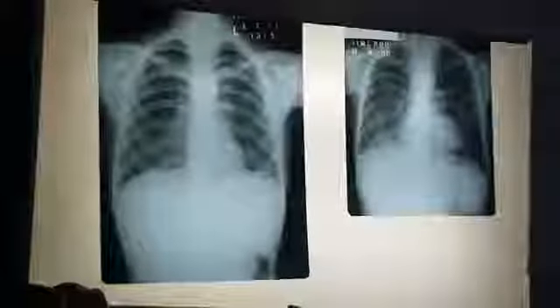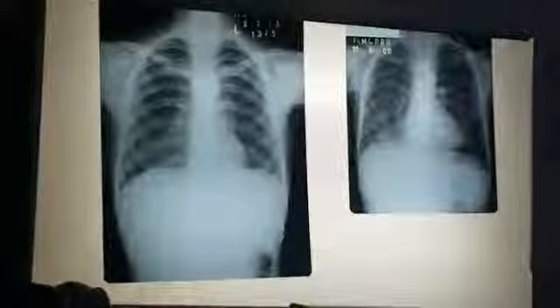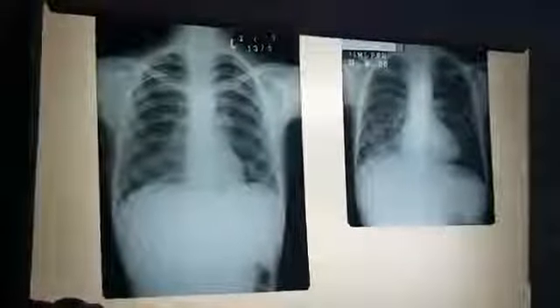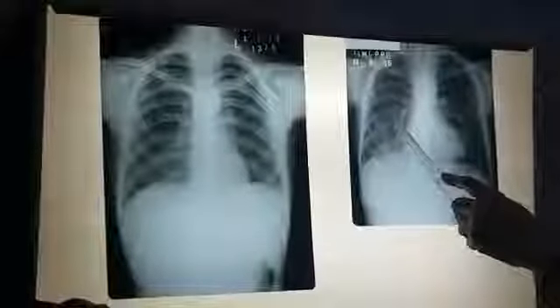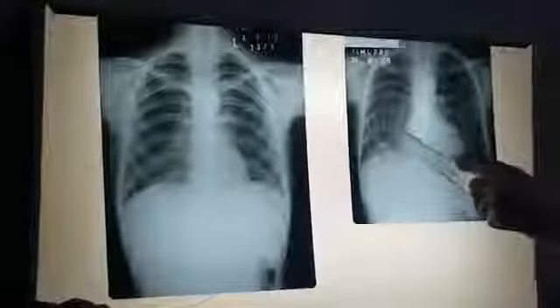As such, naturally, you will not be asked to measure it, but we can say that we can measure approximately. Normally, the size of the seeds on X-ray findings is 0.5 to 2 mm. It is discrete. Discrete means that it is different — discretely, diffusely scattered in both lungs.